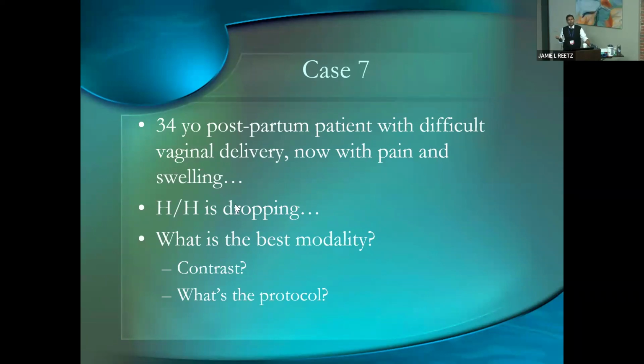Now, what's the protocol? If you just say pregnant patient bleeding and the radiologist is phoning it in on their job, well, let's just do a routine and I didn't see anything, and that's on you because you didn't tell me what to do. But the reality is this would be a situation where you're looking for active hemorrhage. You should be doing a multiphasic CTA. So that's what we did.